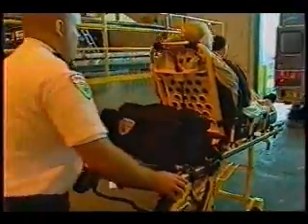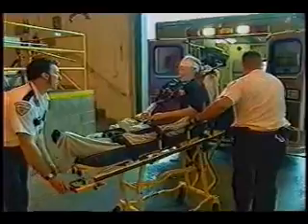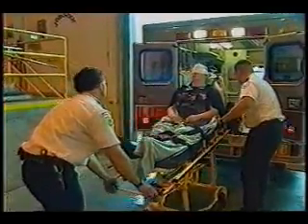To load a patient, approach the back of the ambulance squarely and roll the loading wheels onto the ambulance floor and over the optional safety hook. Pull back against the hook to give the legs room to clear the bumper.